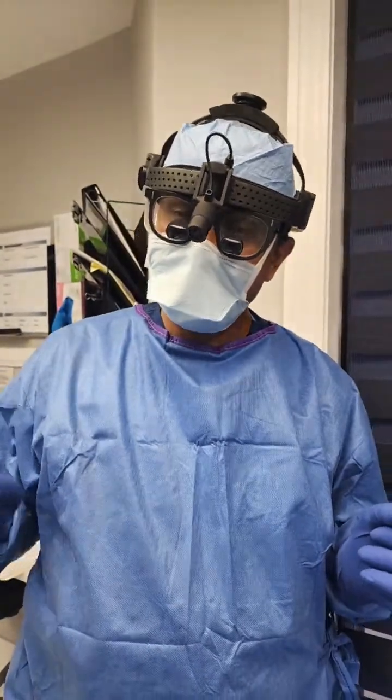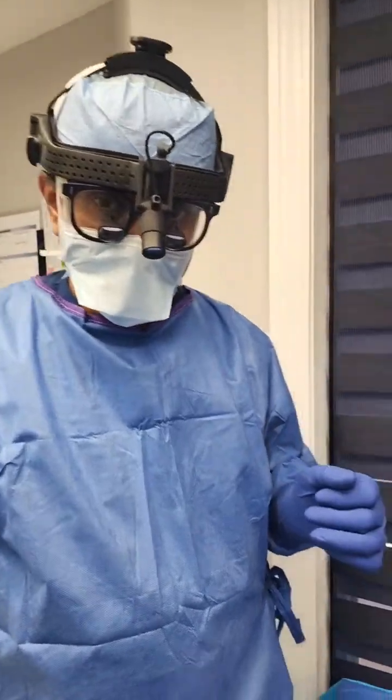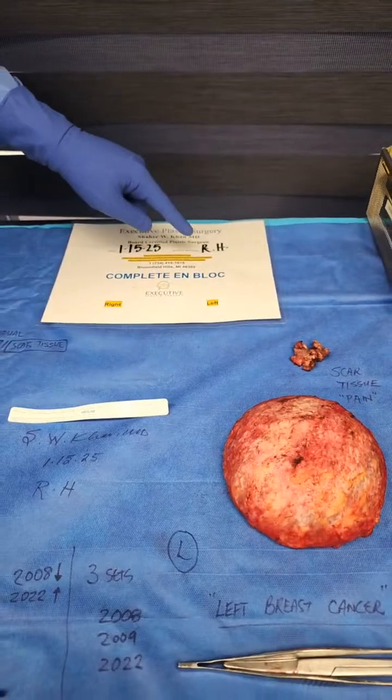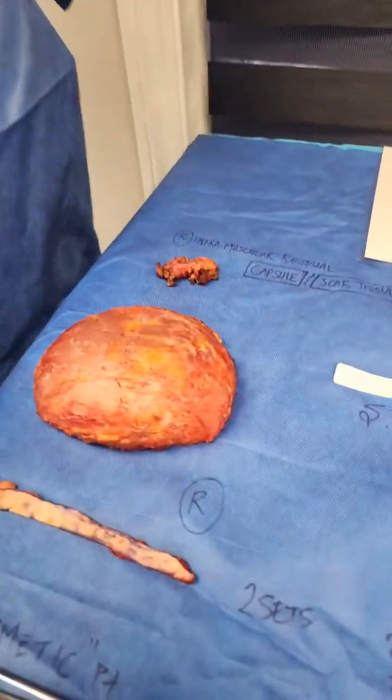Executive plastic surgery. So another Facebook Live, you will learn from this case as well. And again, the whole goal here is teaching. 11525, initials RH. Nice patient from California, very nice case.